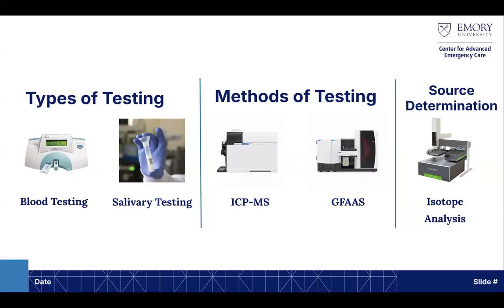Now, as you mentioned, the ICP-MS will measure a variety of metals in your sample, which can be useful, but also can be a problem, because you need to be ready to interpret these results and communicate the meaning of these results to your subjects. And that sometimes is not easy in a research study, or even in a clinical setting. You have to communicate the results to your patients and what they mean, because you will have a variety of metals and metalloids measured, some of which have less clinical significance than others.